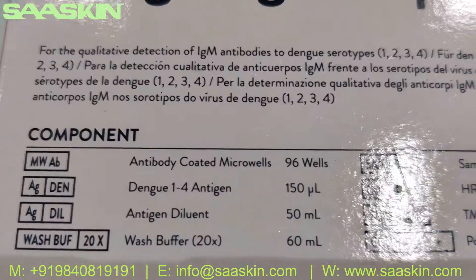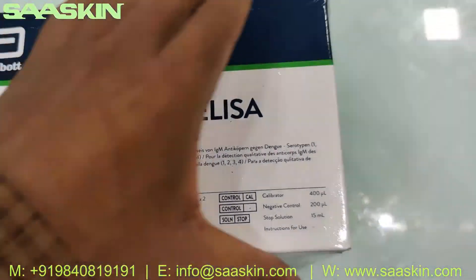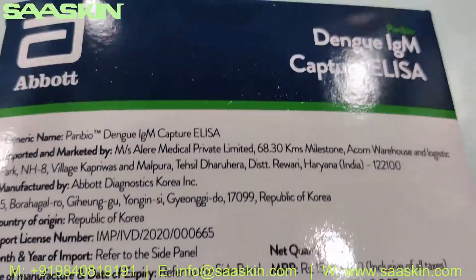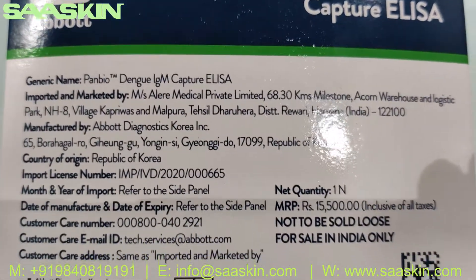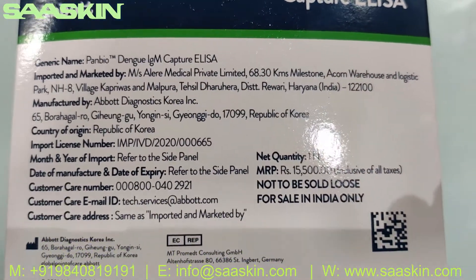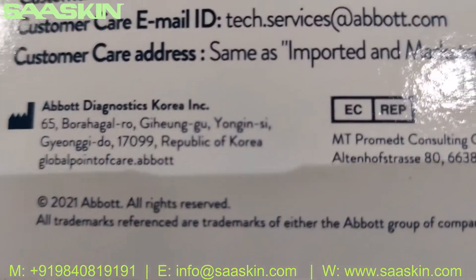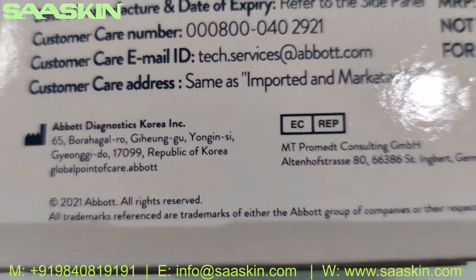The box talks about the contents inside — we're also going to introduce those contents to you. This is manufactured in Korea by Abbott Dynastix Korea.